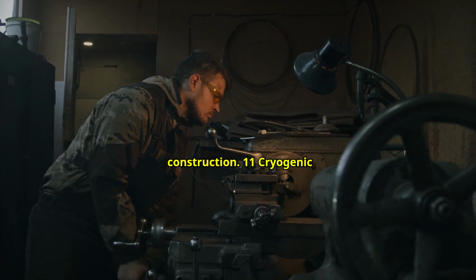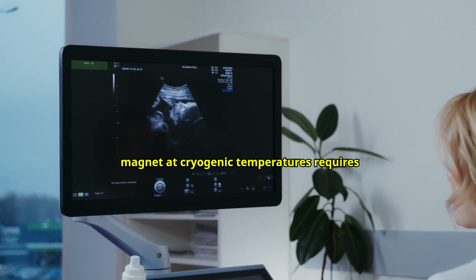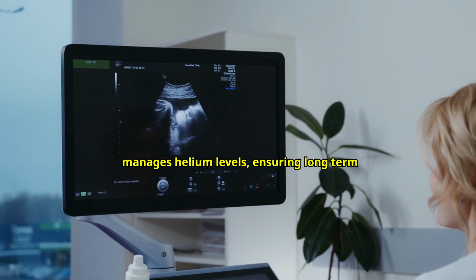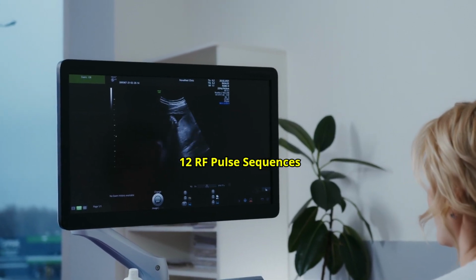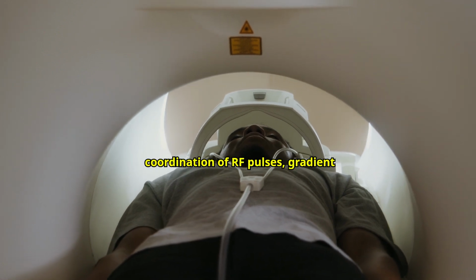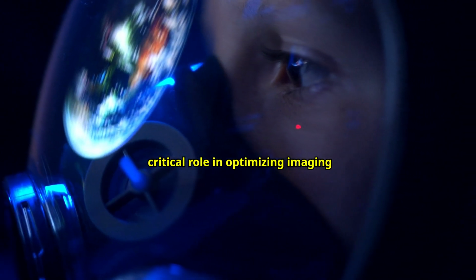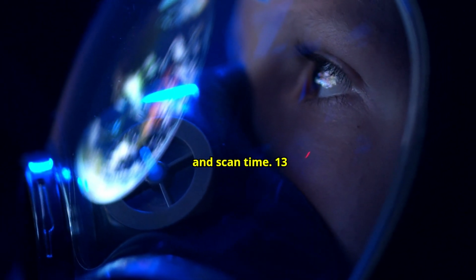11. Cryogenic system. Maintaining the superconducting magnet at cryogenic temperatures requires a sophisticated cryogenic system. This system not only cools the magnet, but also manages helium levels, ensuring long-term stability and reliability of the magnet. 12. RF pulse sequences. MRI sequences involve precise timing and coordination of RF pulses, gradient switching, and signal acquisition. Advanced pulse sequence design plays a critical role in optimizing imaging parameters such as contrast, resolution, and scan time.